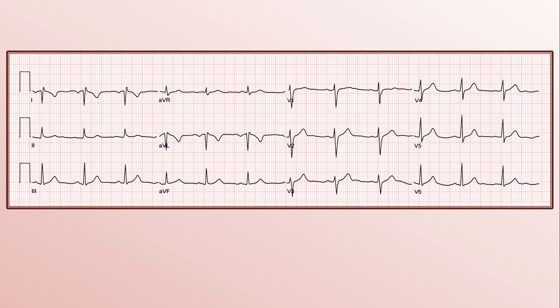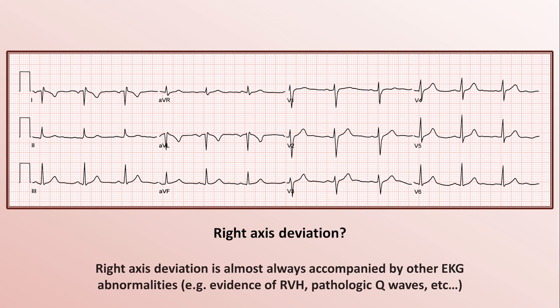Here's an EKG finding I come across on the wards a few times per year. The clinical history in this case is actually irrelevant. At first glance, with a negative QRS complex in lead 1 and positive complex in AVF, it looks like plain old right-axis deviation. However, right-axis deviation is almost always accompanied by other EKG abnormalities such as evidence of RVH or pathologic Q waves. This is an example of lead reversal, also known as lead transposition, caused by two wires being switched when the EKG was recorded.